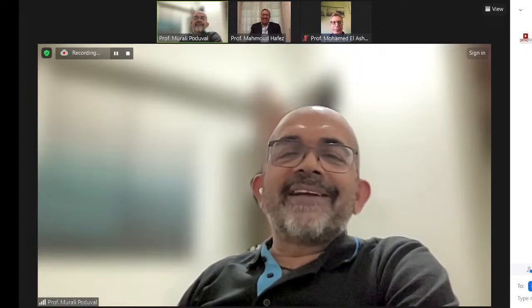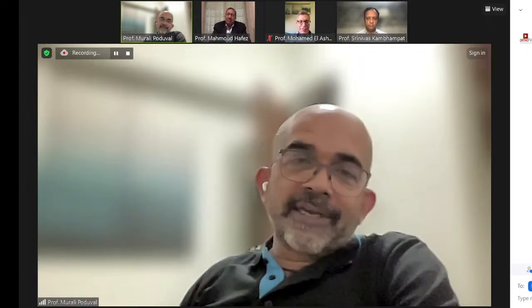Yes, to answer your second question first, I think that's precisely what we all want, right? We want something that is usable, and coming from similar countries, our countries are very similar. You want something that is cost effective, something that occupies less space in the theater, something that makes it easier for you to use. Now, we're talking about AR and VR. Using the headset is not a piece of cake. You get headaches, giddiness, loss of time, and disorientation of time and space. Which will be the right one, we do not know.